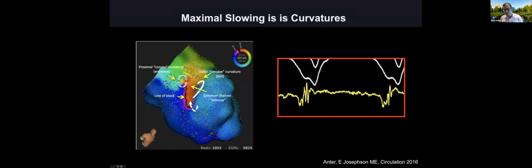And these are the electrograms from there. This is not noise. You have an electrogram here, very fractionated around here, from mid-diastole to the beginning of the QRS, and also at end systole, and all within 2 millimeters apart. This is the distance between these electrodes.